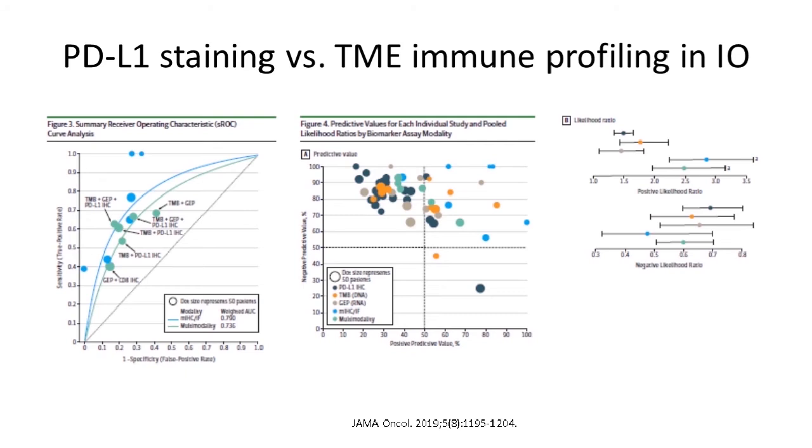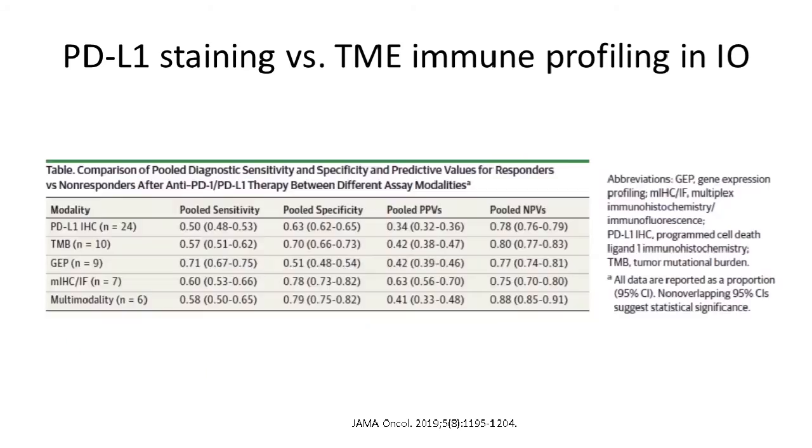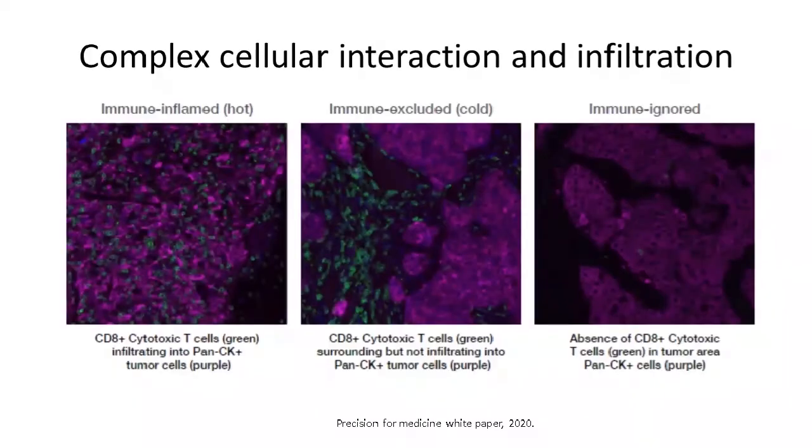And we've combined these approaches in some of the studies that we've done, and this is a different paper in which, in fact, these authors looked at a meta-analysis of these various techniques as a standalone, and it was seen that by using the multiplex immunohistochemistry approach, you can actually achieve a very good area under the curve with very good positive and negative predictive values.